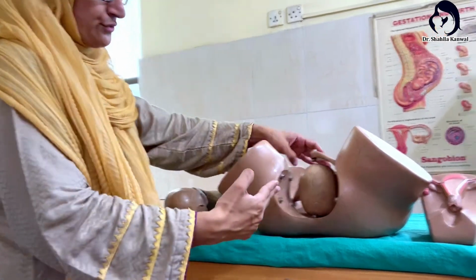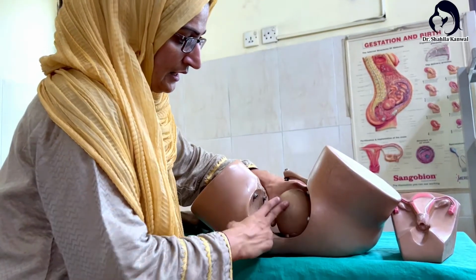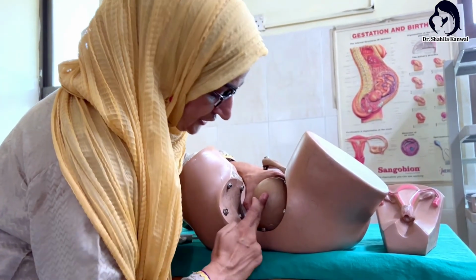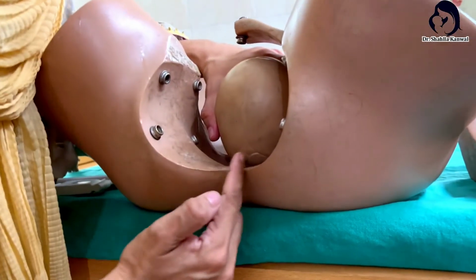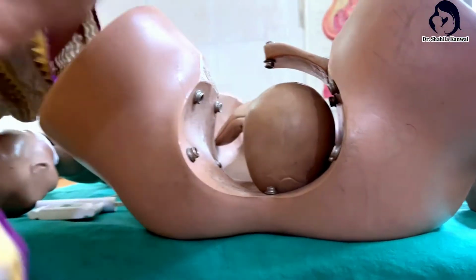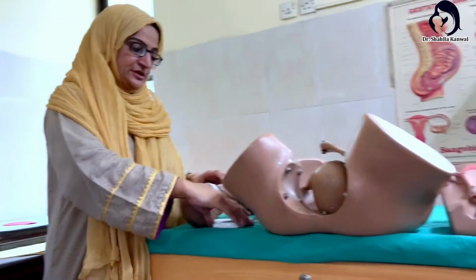You have to introduce your fingers and identify the flexion point, and you will see where your fingers are touching at the posterior fontanelle. This is the posterior fontanelle. Please come closer. This is the posterior fontanelle, so it should be at the level of the posterior fontanelle. You have to measure your distance of the finger, and ideally it is 8 cm.